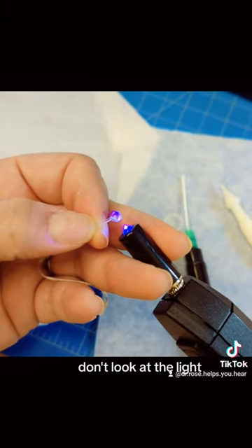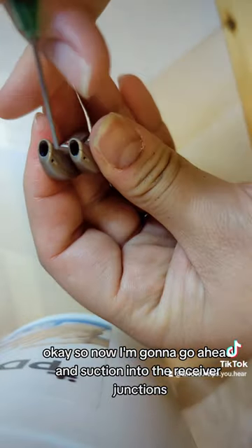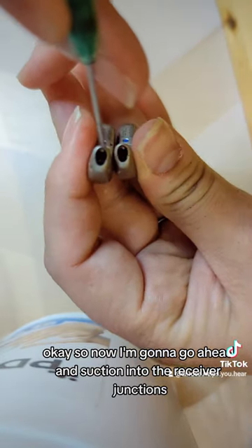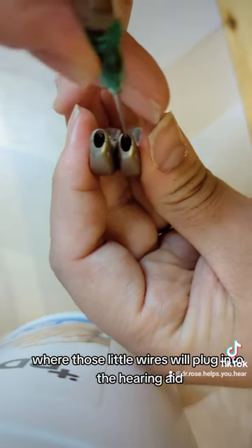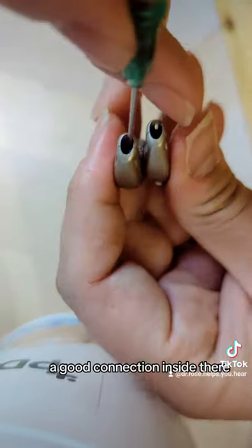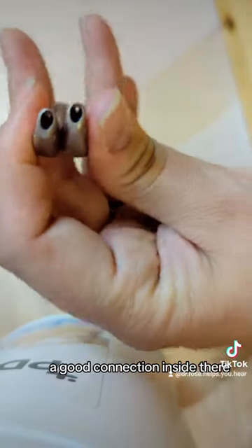Don't look at the light. So now I'm going to go ahead and suction into the receiver junctions where those little wires will plug into the hearing aid. I've already put them in the vacuum chamber for about 10 minutes. It's a good connection inside there.